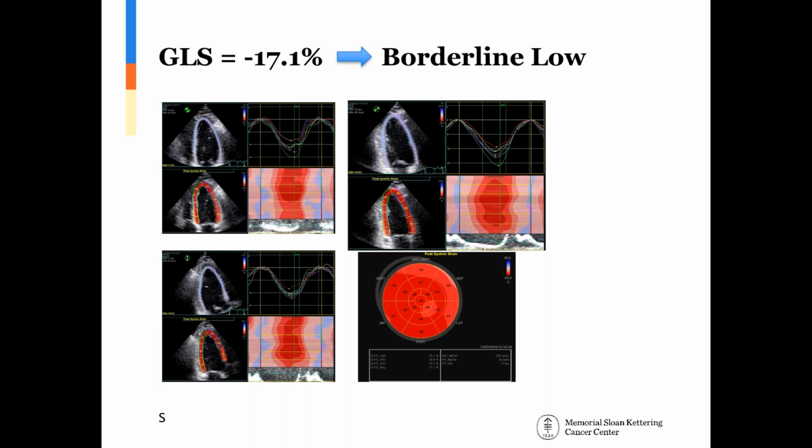We also have some check protocol when we receive an echo. It's probably not very specific, but it distinguishes whether it is a baseline echo, a follow-up echo during cancer therapy, or an echo that is asked because the patient is in a clinical trial. So there is a specific protocol for this trial.